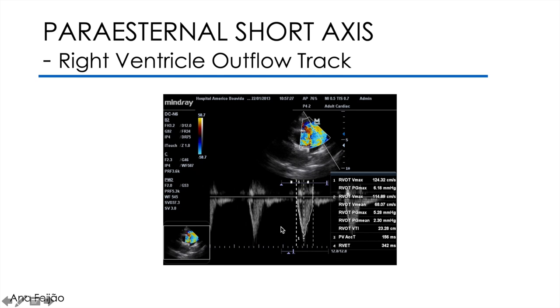I call up the spectral graph by pressing the PW command again. I get a triangular curve, negative because it's a flow away from the probe. It may happen that we have a vertical spike at the beginning of the curve called the closing click, which suggests correct placement of the sample. As before, whenever we activate the spectral graph, it is important to orient the baseline and the velocity scale to visualize the peak of the curve, and orient the gains and filters so the entire spectral curve is well defined. Here I must calculate the peak time — from the beginning of the curve to the peak — and the total ejection time — from the beginning to the end of the curve.